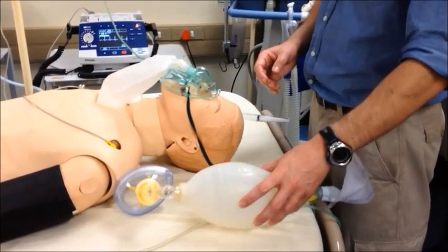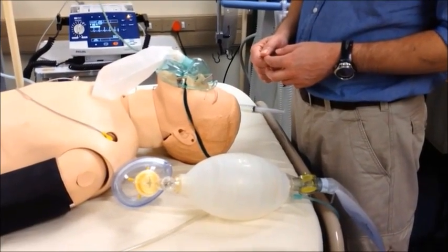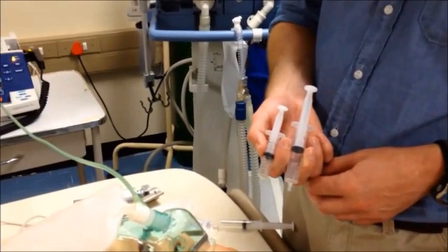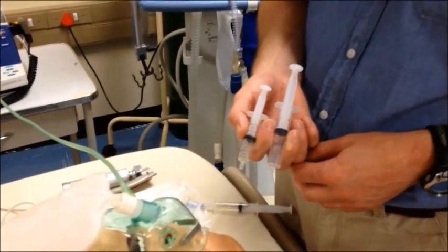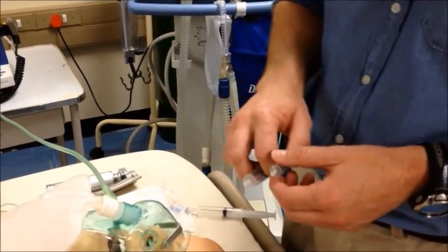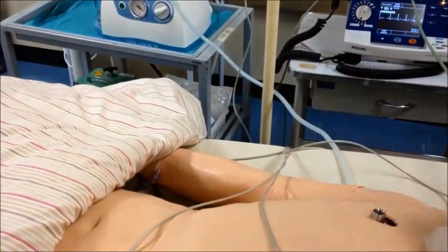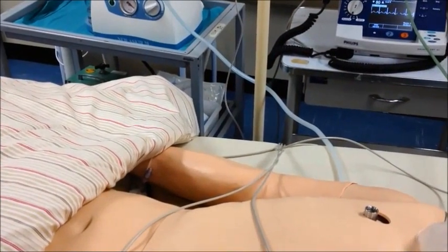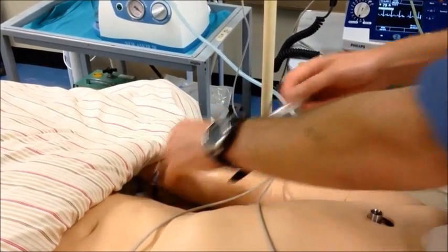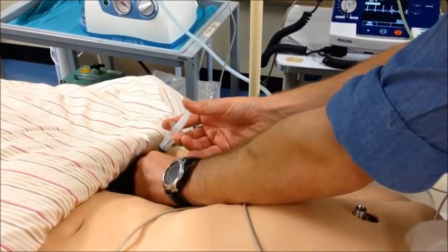Once the patient has been pre-oxygenated, you can proceed with the induction and paralysis of the patient. Administer the induction and paralysis agent in short succession to each other. You could do this yourself or ideally ask an assistant to do this for you. Administer the induction agent followed by the paralyzing agent and finally a saline flush.